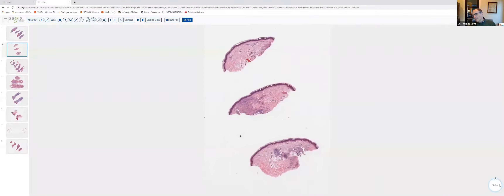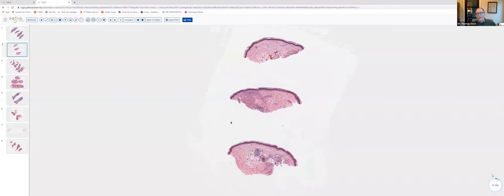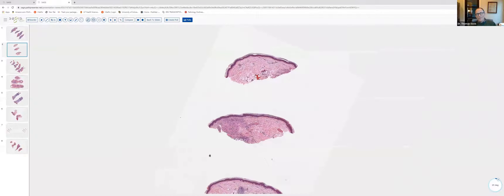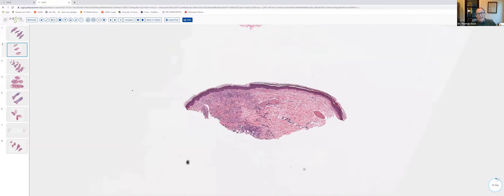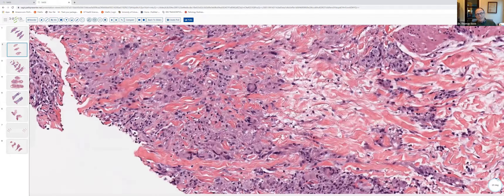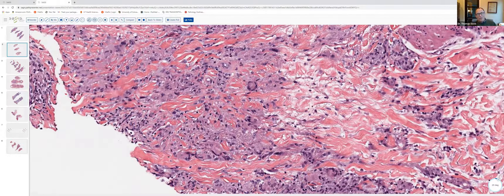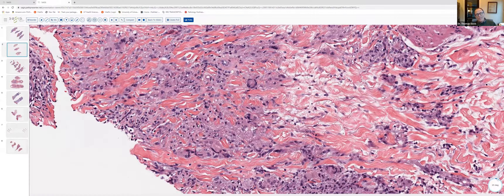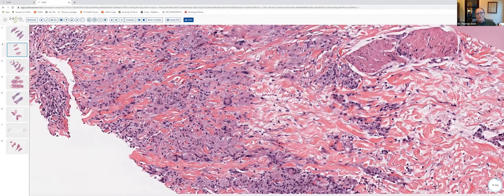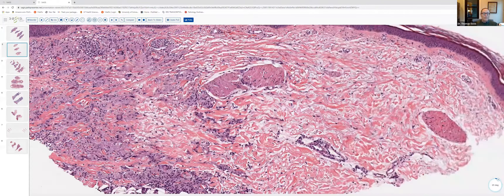Moving on to case number two, which was a really nice example of granuloma annulare. We have a scoop shave with a tapered bottom, and within the dermis you can see nodular collections of cells. The epidermis is uninvolved. The infiltrate is composed of cells with round to oval nuclei and fairly abundant pale or pink-staining cytoplasm — these are epithelioid histiocytes. Some cells are multinucleated, a few attempting to form palisades, but most are located interstitially between collagen bundles. In areas, the collagen bundles are pushed apart by an increased amount of dermal mucin. This is a patchy infiltrate very characteristic of granuloma annulare.